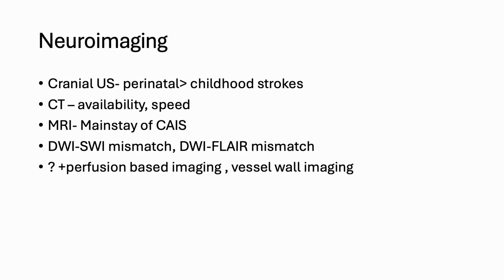So as we spoke about earlier in the talk, it is quite important to image cases of pediatric stroke within a certain time window, and actually one of the causes of delayed stroke diagnosis can be neuroimaging. And along that theme, whilst an MR is the gold standard for diagnosis, sometimes performing an MR out of hours can lead to a delayed diagnosis of the stroke, and in those instances a CT is preferred. It can be quick, it can be performed without sedation, but it unfortunately does have a lower sensitivity compared with MR. Now, MR imaging at a minimum should include DWI, SWI, and ideally an MRA brain and neck.